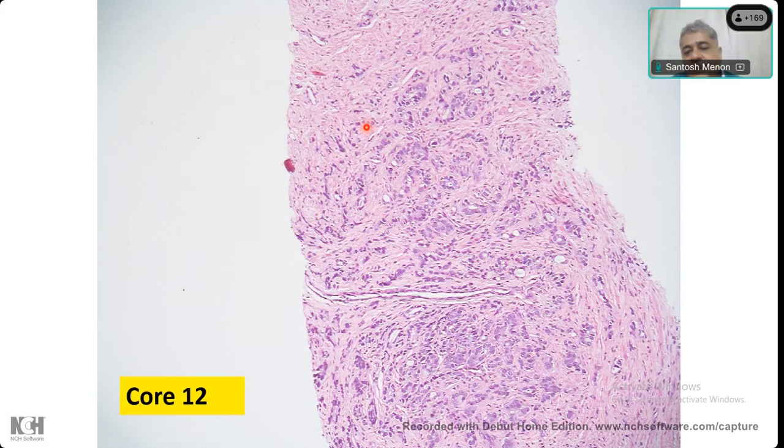So you might sometimes struggle with Gleason scoring. There is some gland which you can draw a line, you may call it 3. Fine. There are some poorly formed which you will call 4, and then you have some 5. So this is a common scenario. I'm not trying to tell you what the score is, I may be correct, I may be wrong. The point is you will have mixtures of Gleason patterns in many of the cores.